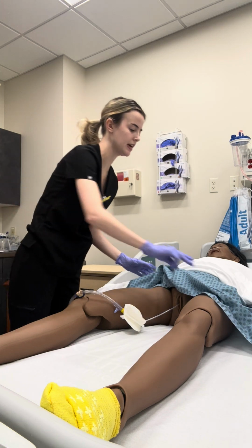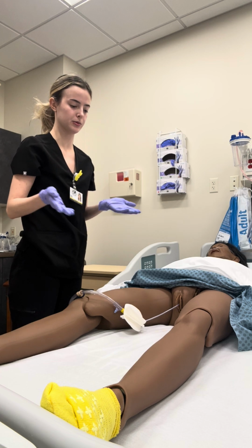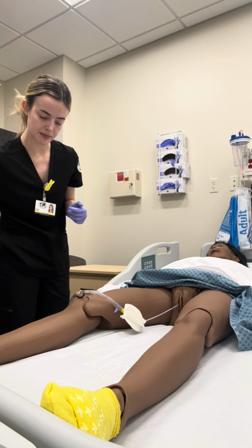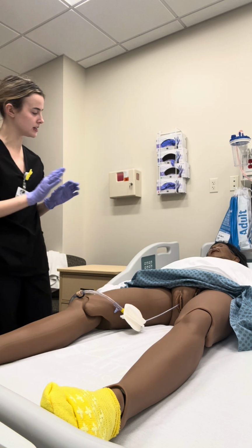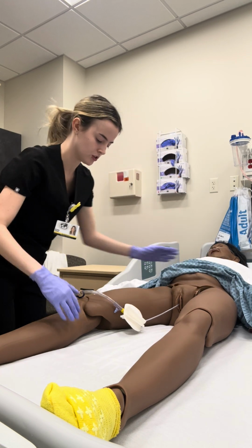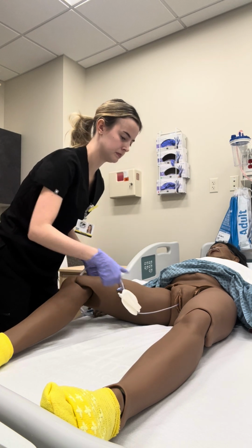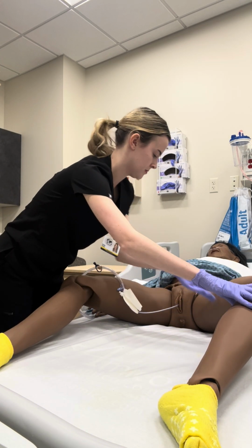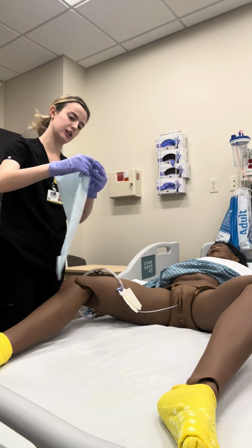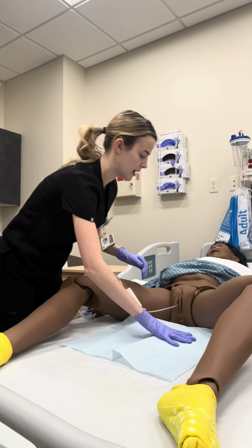Okay, so then once again, I would perform any peri-care while the catheter was in, and then I've performed hand hygiene, put on gloves, emptied the bag, and I'm going to have you get into the same position that we got in when we inserted the catheter. So we're going to raise your legs. Perfect, and I'm just going to put a disposable pad underneath you. This is just in case it were to get a little messy. We don't want to get the sheet stained, okay?